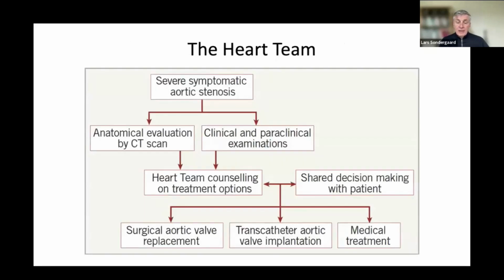And as Magnus was saying rightly, that can only be done if you have a CT scan up front. And I think this is what many contemporary heart team flowcharts look like today.